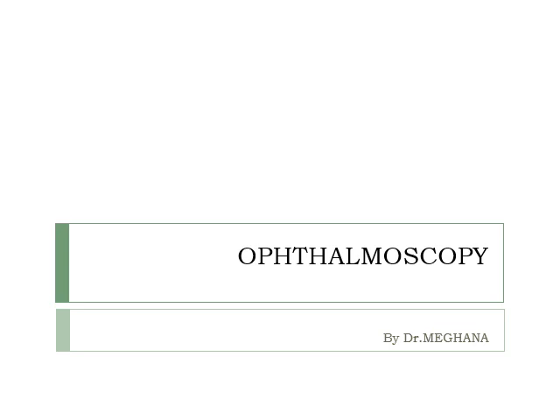Good morning everyone. Today's topic is ophthalmoscopy. Ophthalmoscopy is a clinical examination of the interior of the eye by means of an ophthalmoscope. It is one of the techniques of fundus examination, and this is primarily done to assess the status of the fundus and to detect any opacity of the ocular media.